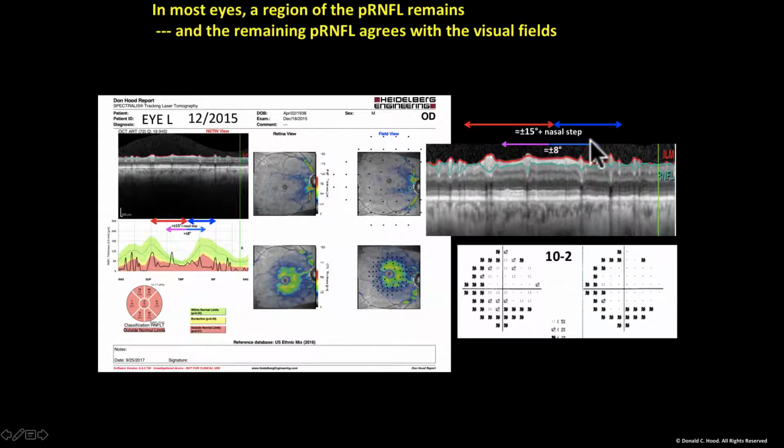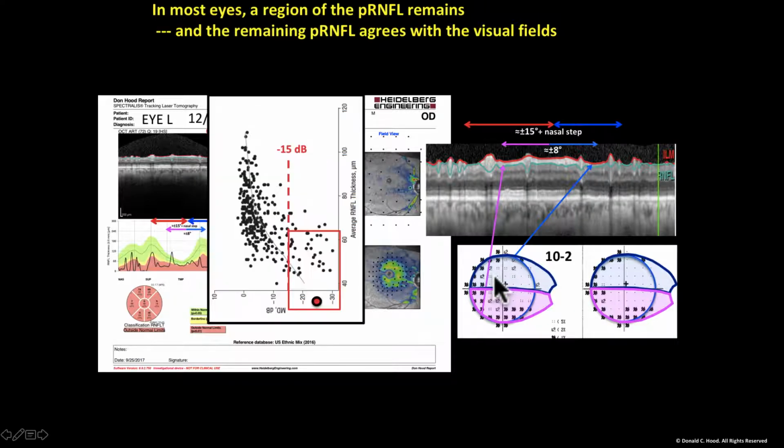So this is plus or minus 8 degrees. This is plus or minus 8 degrees. So let's put our model on top so that this region inside the model, on the circumpapillary plot, goes from here to there. So this is the region you want to worry about if you're trying to preserve this part of the visual field.